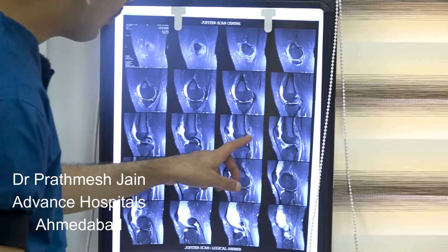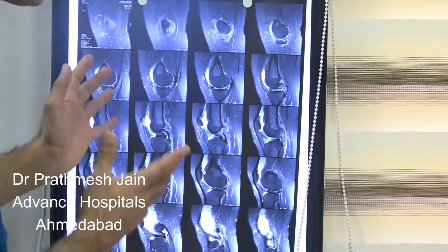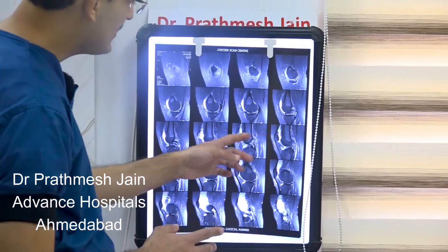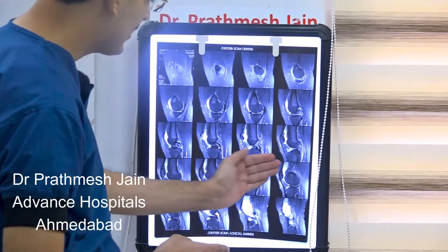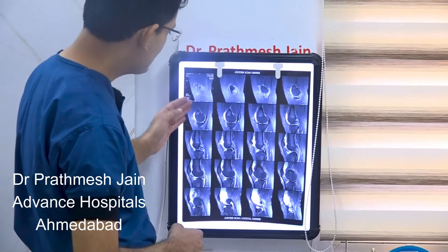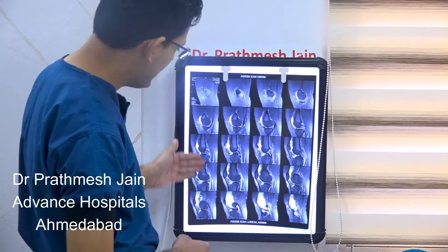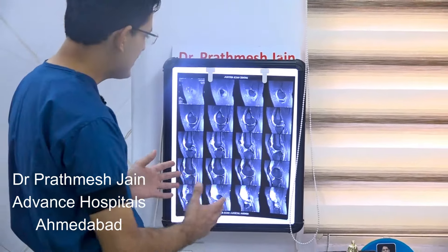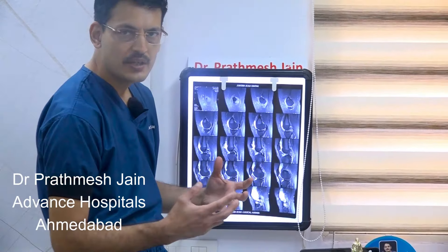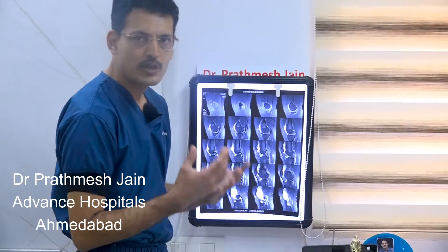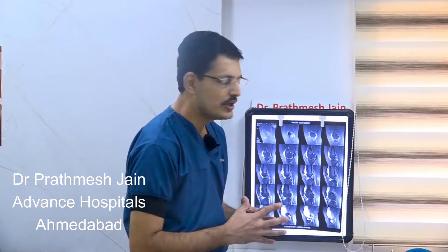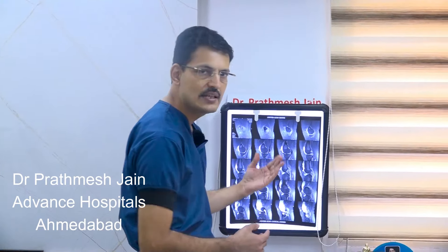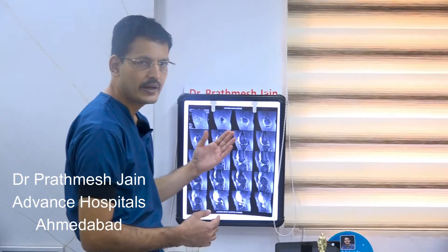The ACL fibers are not well visualized — it looks like a Sherman grade 2 or 3, a bad ACL injury. The lateral compartment appears okay. This is accompanied with effusion, suggestive of an acute injury. Basically, an acute pivotal twisting mechanism to the knee leading to the ACL tear as well as the locked bucket handle tear.